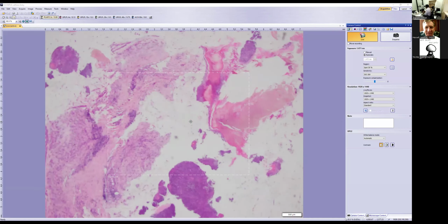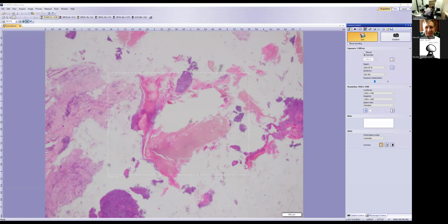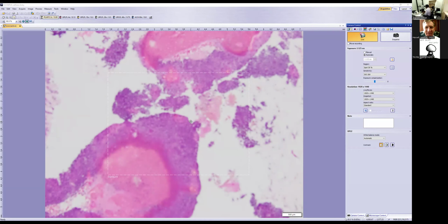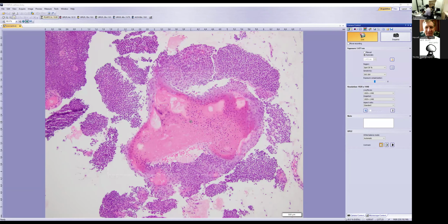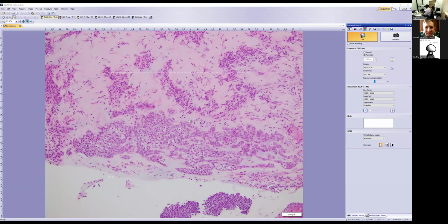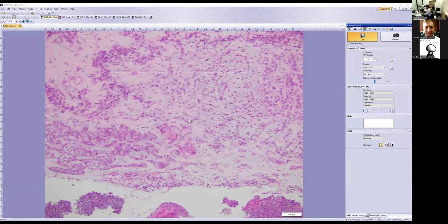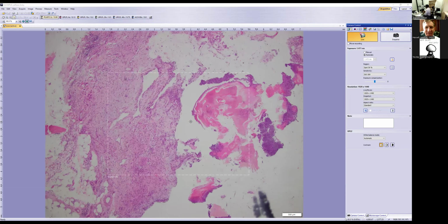One thing that was clearly standing out were these keratinizing squamous epithelium with the associated tumor cells. And then we had the stroma where we had what looks like an infiltrative pattern of cells with some kind of desmoplasia. And the whole biopsy was fragmented.